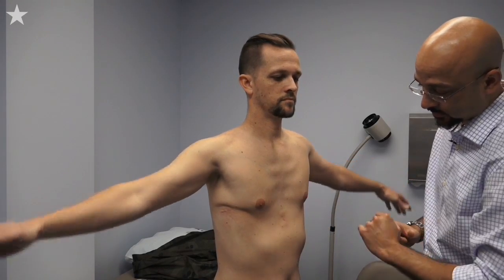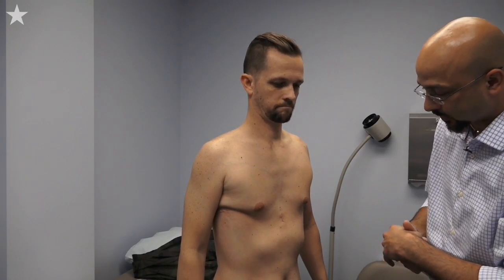We make a small little incision there that we actually used our finger in, so when that bar goes across we protect the heart so that there's not an injury to the heart.